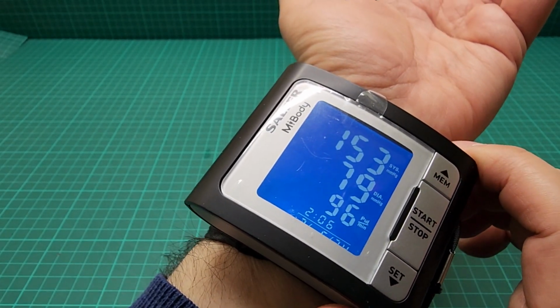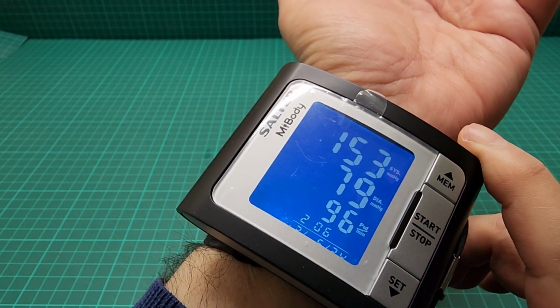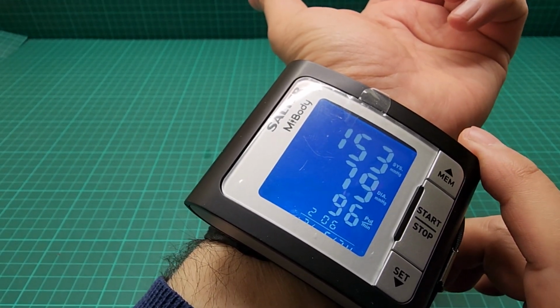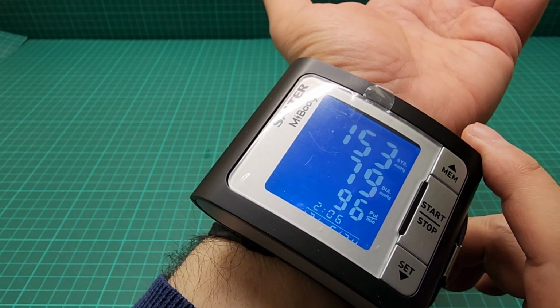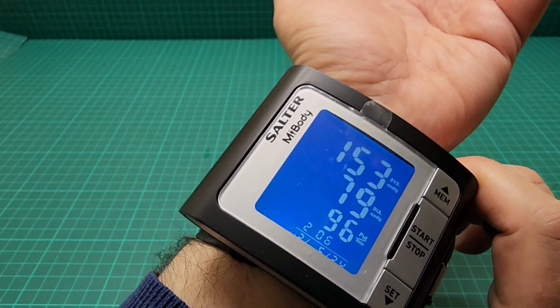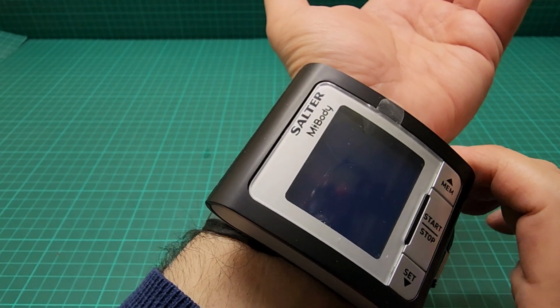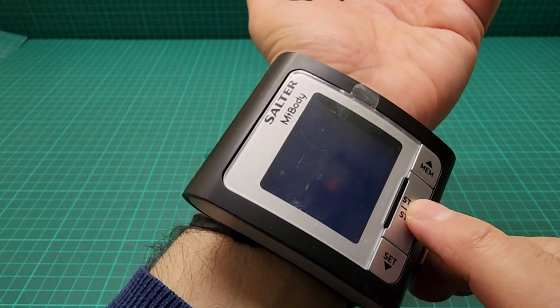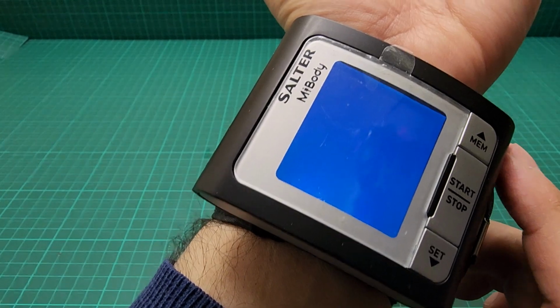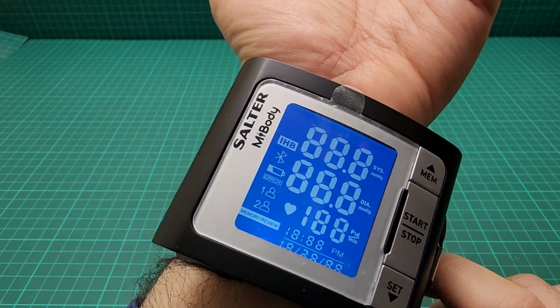You can download the app, and the app is going to store all of this with a time stamp for each reading, the time and date when you took it. This is very good, relatively, and it has a safety feature that it switches off by itself to preserve the battery. But because of the excitement that I had, I talk too much. Anyway, we take it once more and we end this video.